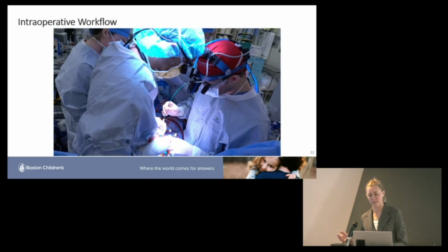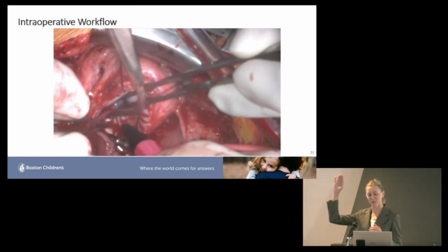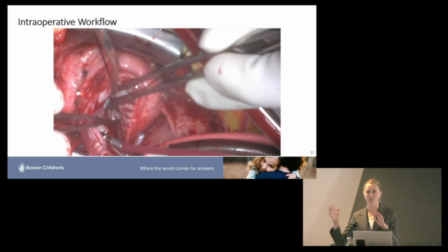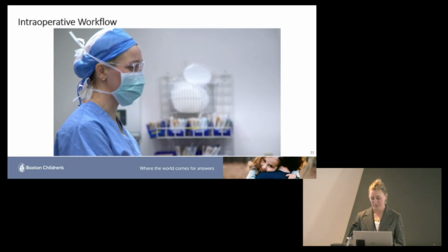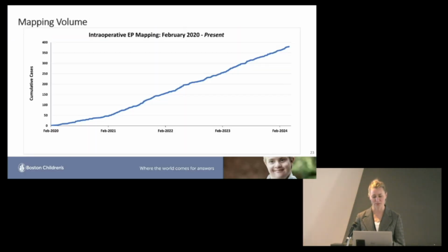because that can also be very helpful if you know that you need to put that VSD patch in, and you have conduction at the superior aspect. Perhaps you adjust where that patch goes, and that can allow us to avoid that complication.